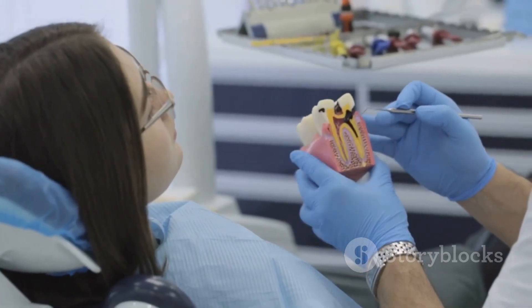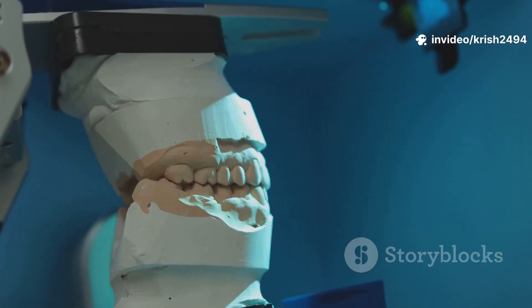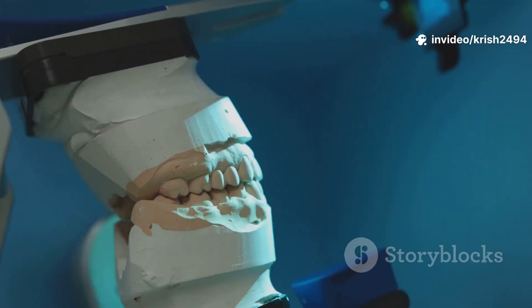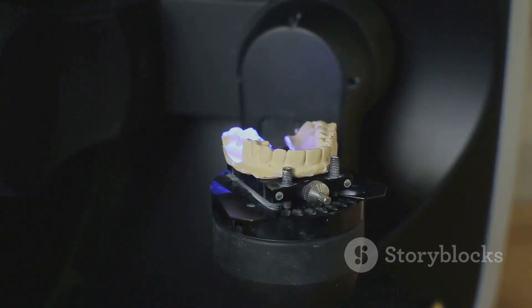And finally, follow-up and adjustments. Over the next few weeks, you'll come back for tweaks to make sure your dentures are comfortable and working well. And that's the complete workflow of how dentures are made, from start to finish.